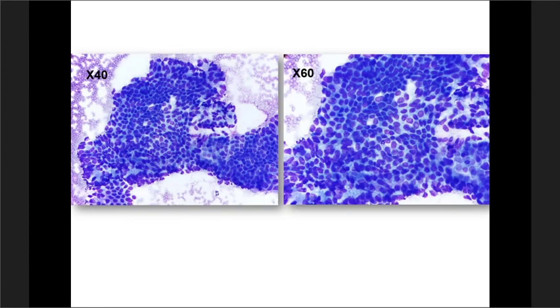And here it becomes a little bit clearer by the presence of significant anisonucleosis. Look at the nuclear membranes here in this area. Quite a bit of irregularity is also noted there. So these are the two criteria I'm using, starting from low to high magnification, to assess these groups of cells. And if I have enough groups like these, which I can say suffice for about 500 or more cells, I would be happy with calling this adequate, and if pushed further, may even give out a diagnosis of an adenocarcinoma.